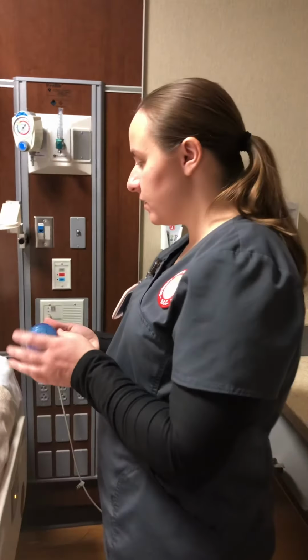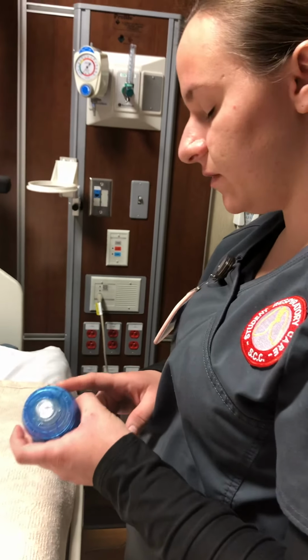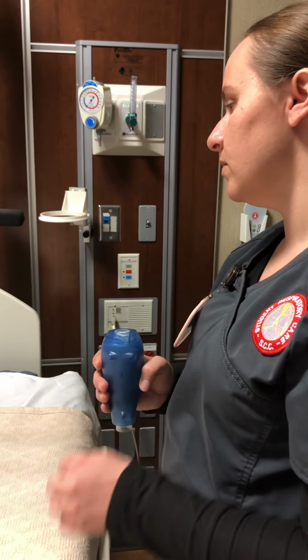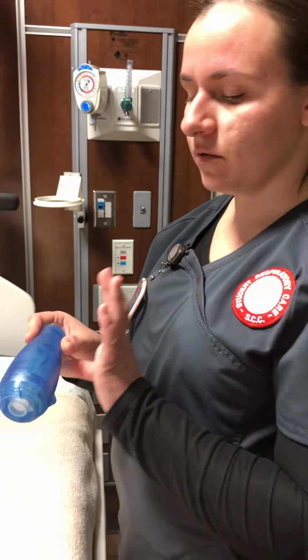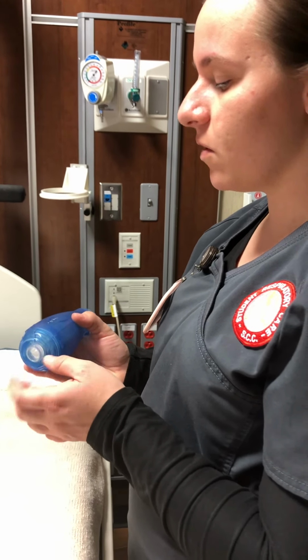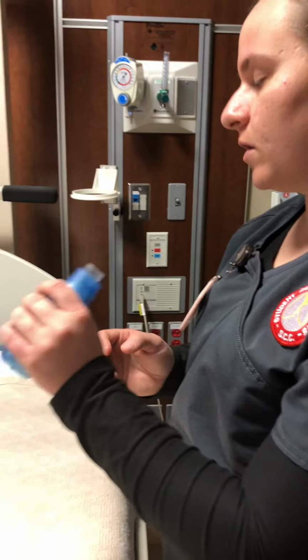Alright, so here I have what's called an acapella, and I'm going to set it at the lowest rate to start you off with. That way it's a little easier for you to start with, and then we will increase it as your lungs get stronger and are able to cough up those secretions more. When you're holding this, you don't want to cover this. You want to leave this open because there's a little valve in there that will flutter when you exhale out, okay?